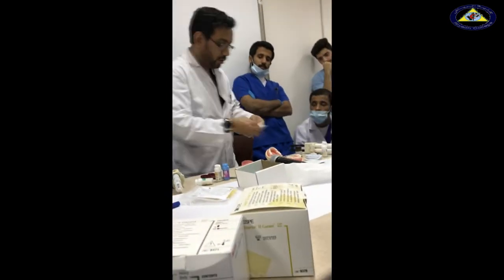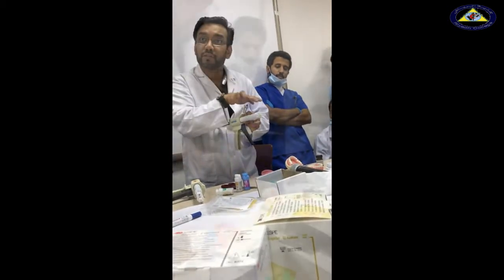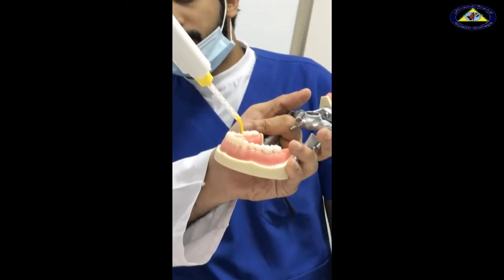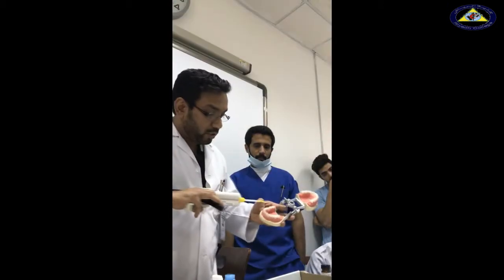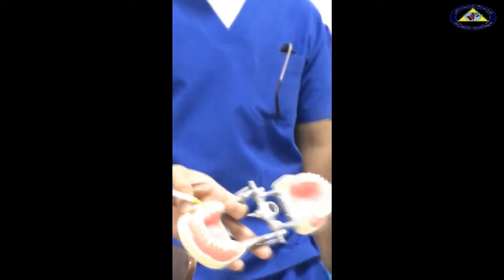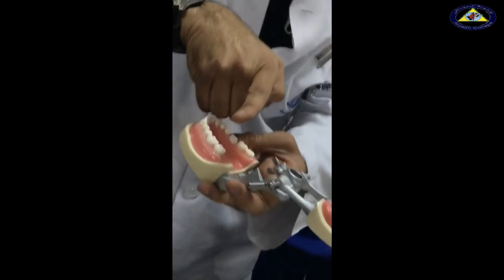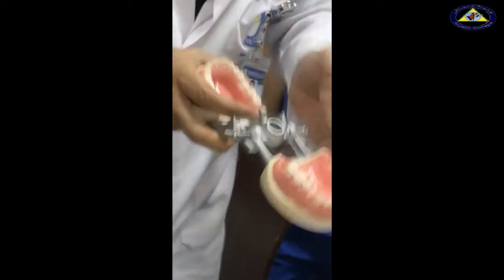Dispense a little bit of the material on tissue paper so that you know both are giving equal quantity. Many people make the mistake of injecting straight on the proximal surface — what happens is you may incorporate an air bubble. I always hold it at an angle sideways. So when I'm injecting, the material flows from one side to the other, pushing any air in the proximal area. It's like a river flowing — the material flows through to the lingual side.